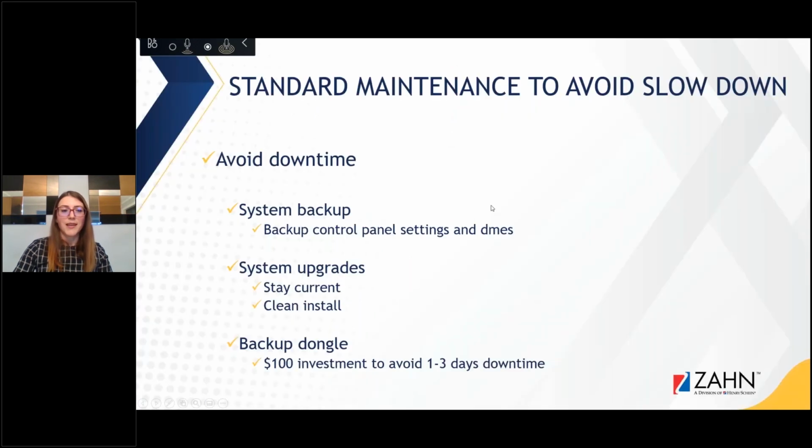All right, a few other things that you can do to avoid downtime or slowdowns. So system backup, this is something that we went over, right, doing that export and import. When you do that material export, that's going to be all of your files that you need. So if your computer crashes and you have to purchase a new computer, you have to do a brand new installation of 3Shape, that will have all of your previous information.